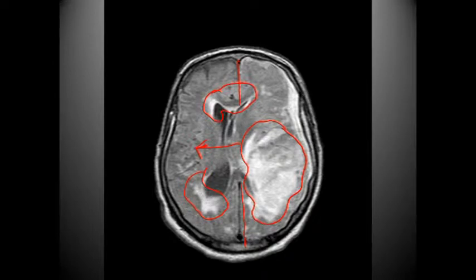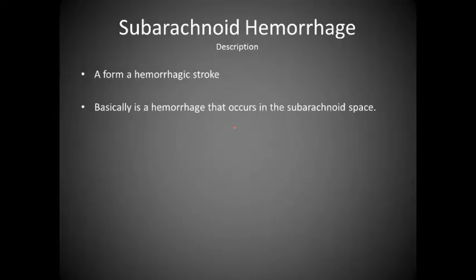All of these areas are blood. And there is the possibility that this patient does have some type of trauma to the cranium, which would cause that blood.